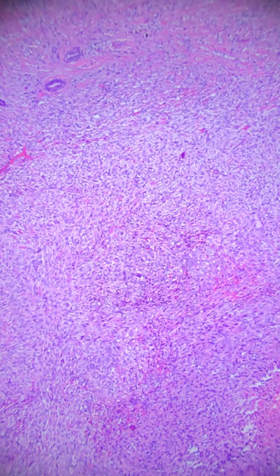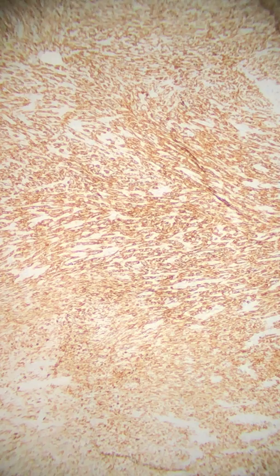These tumors often are hormone negative, so they're going to be ER/PR negative, HER2 negative. But where they will help you are things like your keratin. So what I'm going to show you guys here, and again, get in focus. High molecular weight keratins will be positive in these tumors. So this is a CK903, also known as 34 beta E12.